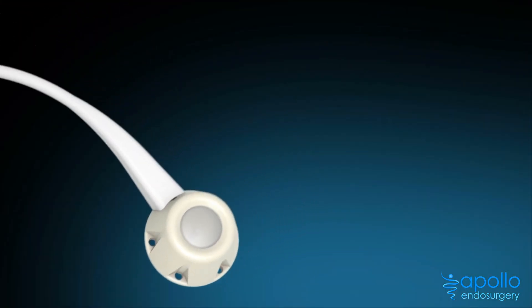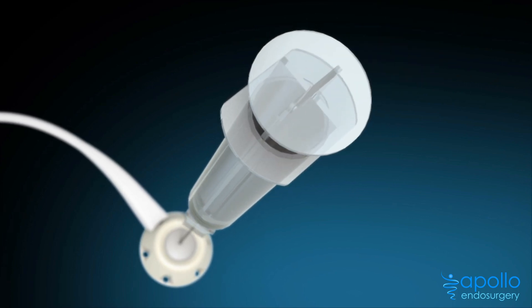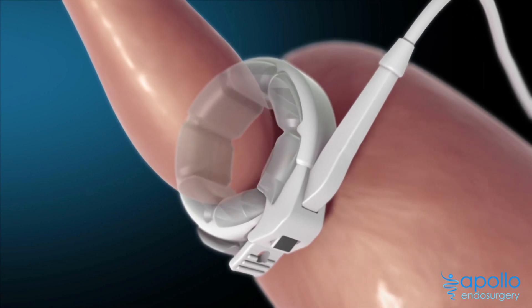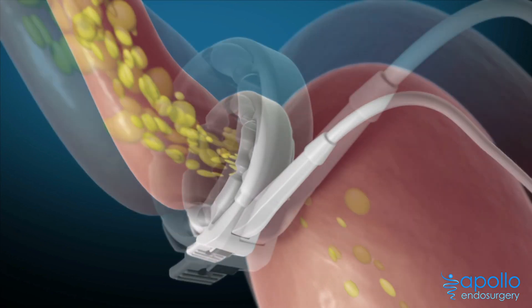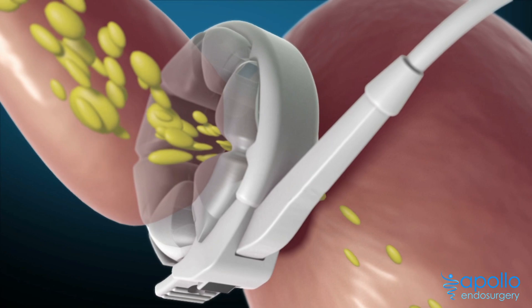Through this port, your surgeon adjusts the lap band by inflating or deflating the inner balloon with saline. As the band inflates, the stomach outlet becomes smaller. This helps reduce the amount of food you eat and slows the emptying into the lower stomach, helping you feel full sooner, stay full longer, and reduce hunger urges.